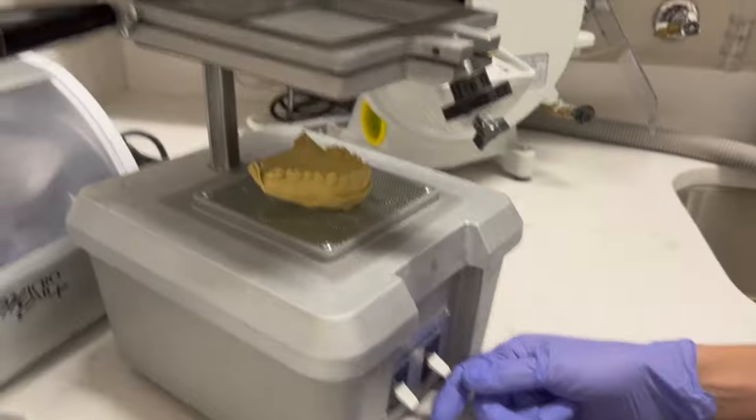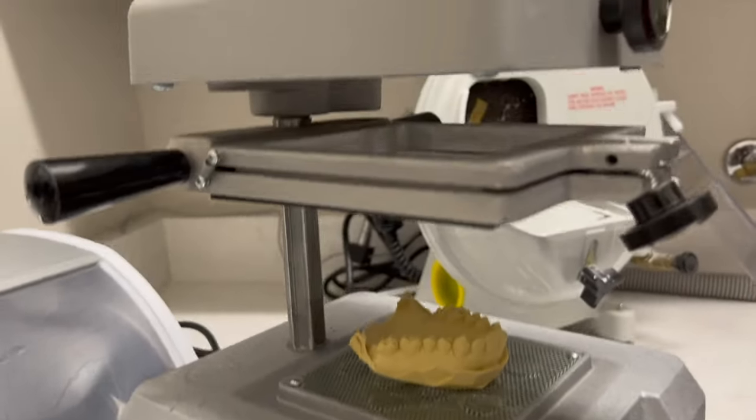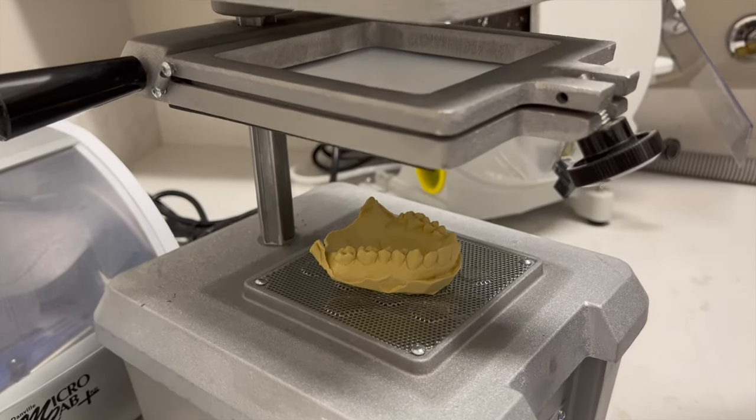It will be placed into the vacuum forming machine. Your model of your teeth will be sitting in the vacuum forming machine, which is the thing that makes the whitening trays.